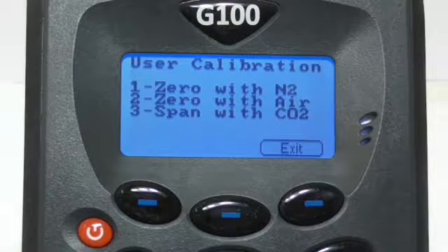For this video I will be using nitrogen as it will give us a more accurate calibration, so this is our recommendation. But if this isn't available, a soda lime filter can be used instead. If neither of these are available, air can also be used; however, please bear in mind if this option is chosen, it should be carried out in a well-ventilated area and not in the office or lab.